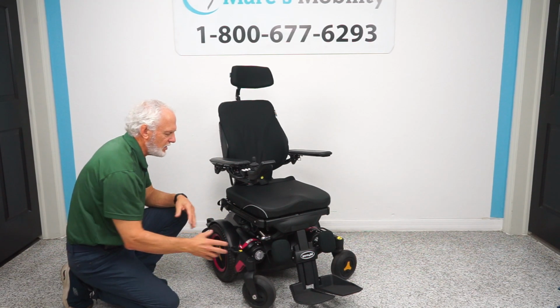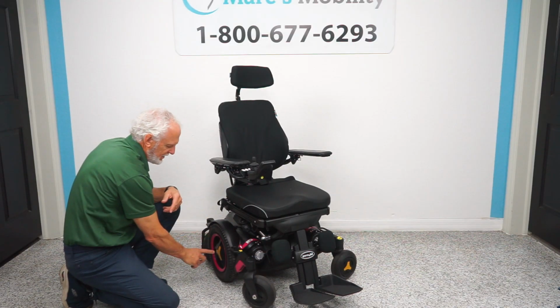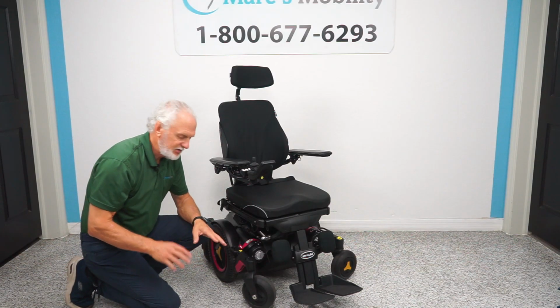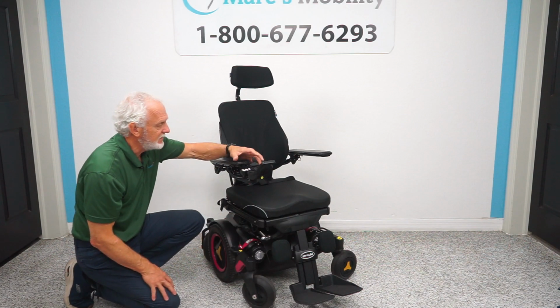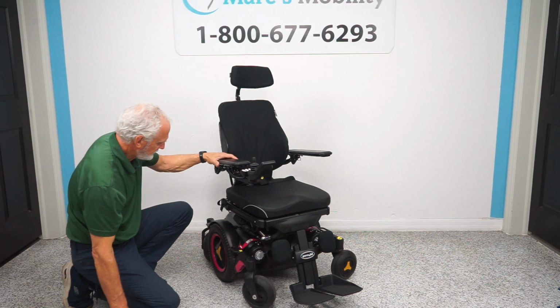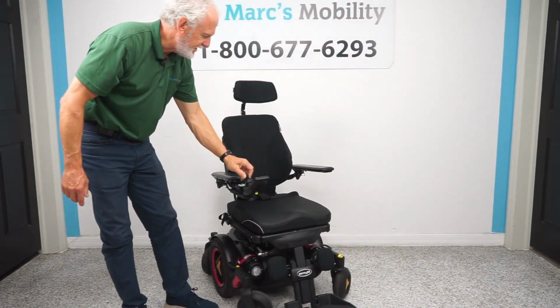So all M3s, the levers are here in front of these motors right here. The motor goes directly to the wheel. The motor starts here, goes all the way to the wheel. It's connected to the hub. No chain, no belt. Very consistent, okay? We're going to put the power back on. And we're going to talk about the seating system.